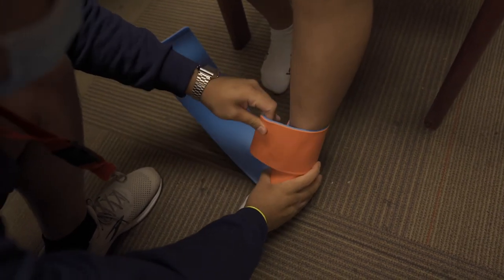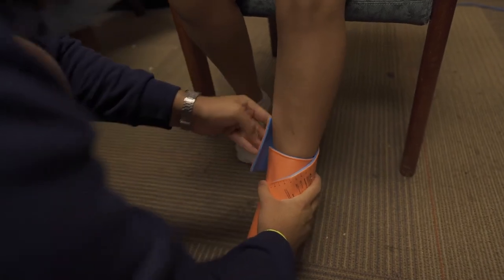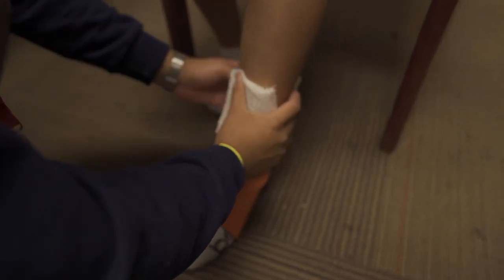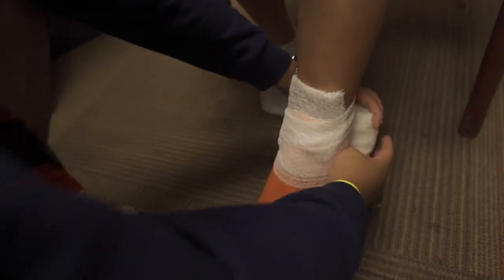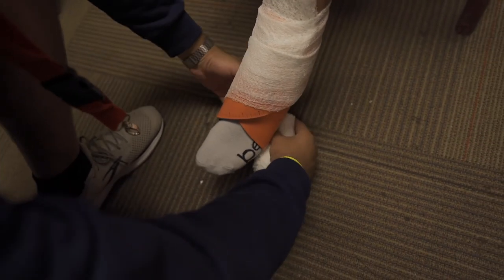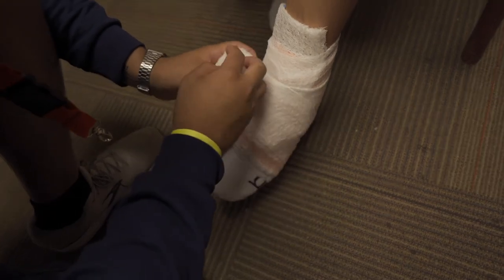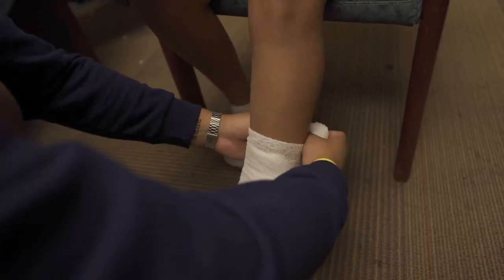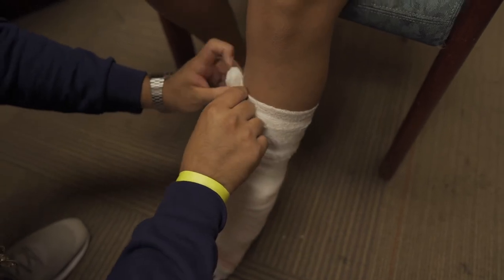Go even higher than that, then do the other side. John's going to grab a roll of Curlex and come down with it — about 50% down each side, going higher than that. He's eventually going to come under the foot and then come back up, leaving the heel exposed and the foot exposed. Then come back up and go all the way up to the calf. Tuck it in at the very top.